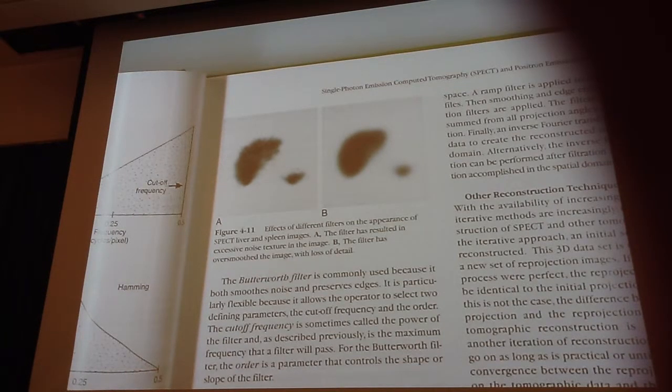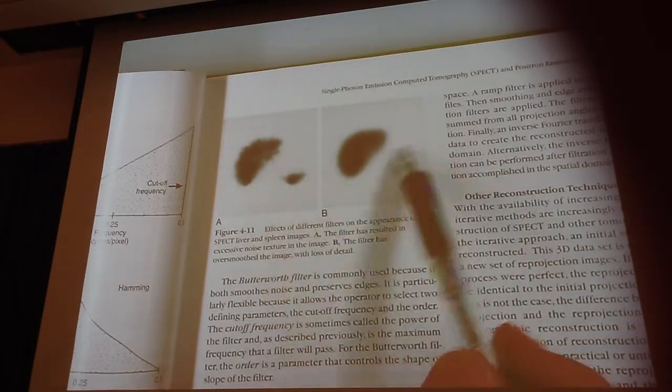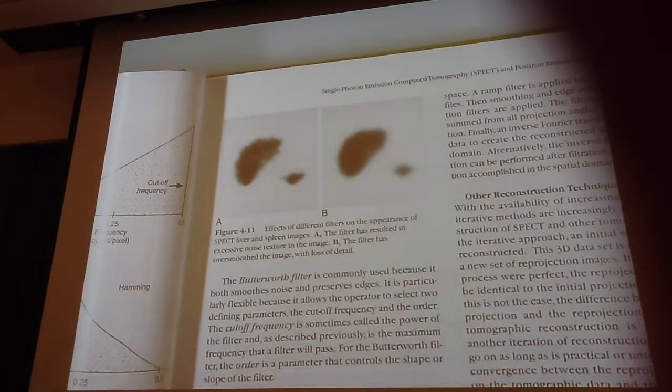And you don't want to be in that position. If you have a doctor that says, I don't want this image looking so smooth, well, then you could increase the filter cutoff and sharpen the images.